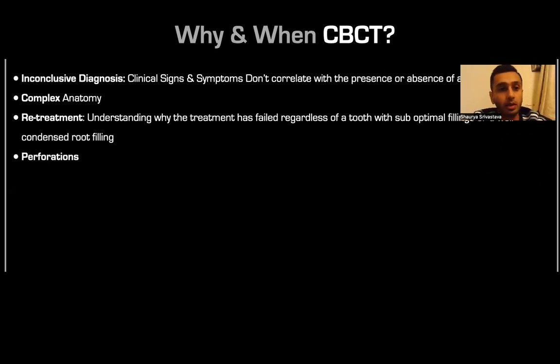So that's one. Then we have perforations. Again, you may not see a perforation on a radiograph, but you have to have clinical testing in place to suspect that there may be a perforation and therefore refer a CBCT. You may have a CBCT in-house, that makes your life much easier, but most people don't. So if your diagnostic tests are not in place, you might not know what's going on to actually refer a patient. And perforation is one of the tricky challenges that you may face as well.